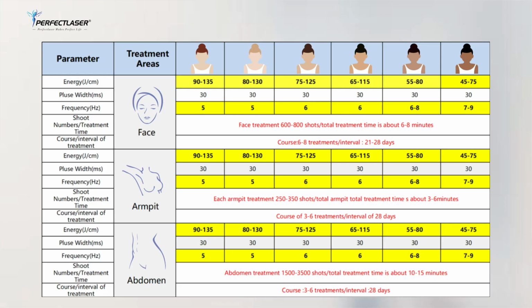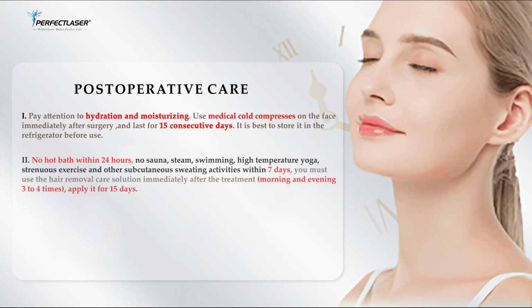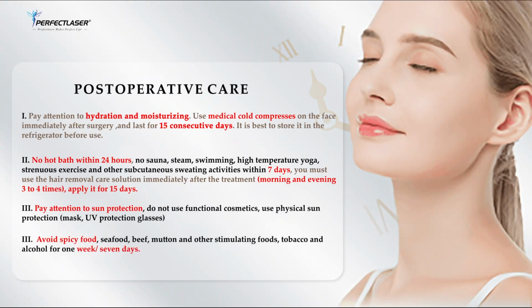The parameters are for reference only. It is recommended to start with low energy and adjust the parameters appropriately according to the customer's feedback during treatment. The specific number of light spots is for reference only. It will be different according to the physical condition of different customers, and the endpoint response of the treatment shall prevail. After treatment, it is important to pay attention to hydration, sun protection, dietary restrictions, avoid vigorous exercise, and follow medical advice for corresponding skin management.